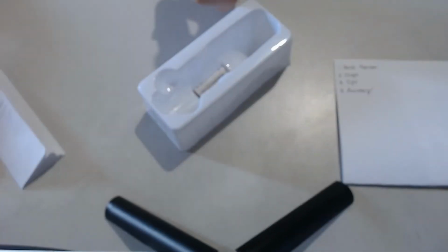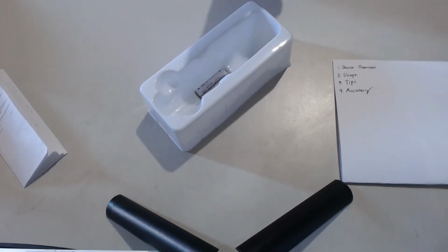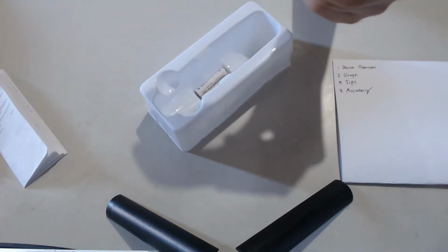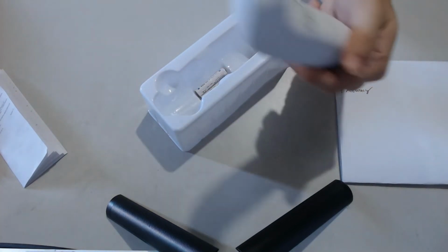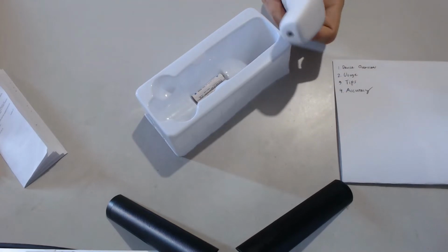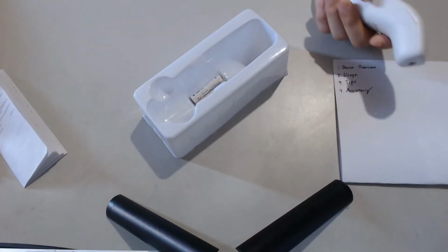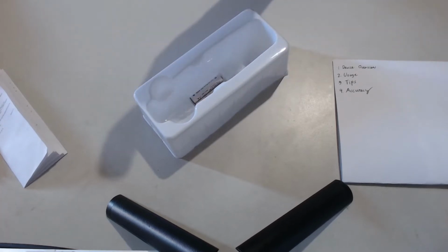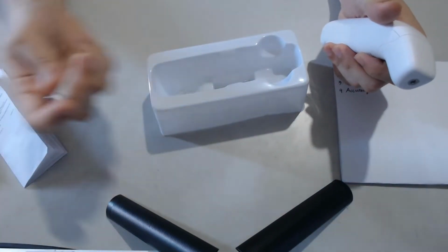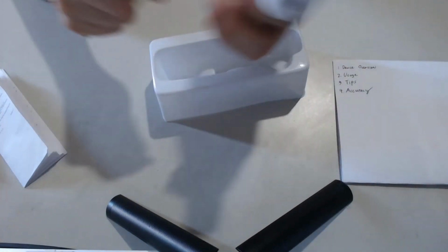Tip number two is with these thermometers, if the battery is low, change or charge the battery. You don't want to be using this when your battery is questionable, because this relies on infrared, and if the battery is low, we're not so sure how it's calibrated. If it does auto calibration, the measurement will get lower than usual. So instead of 37, you'll get 36 or 35. Make sure to keep your batteries fresh, or at least not low. I'm using this one so I can charge it. I can always charge my Eneloop batteries prior to use.